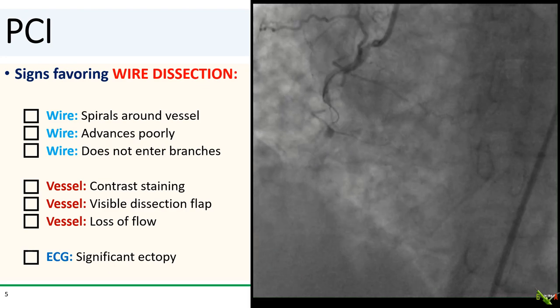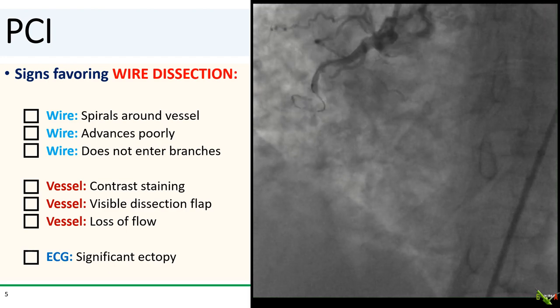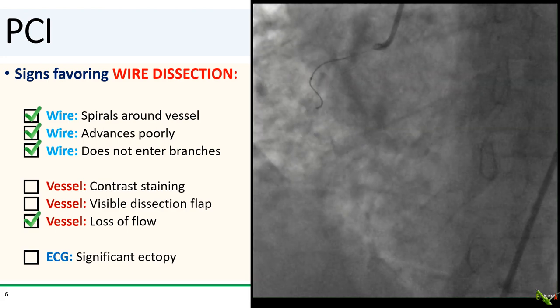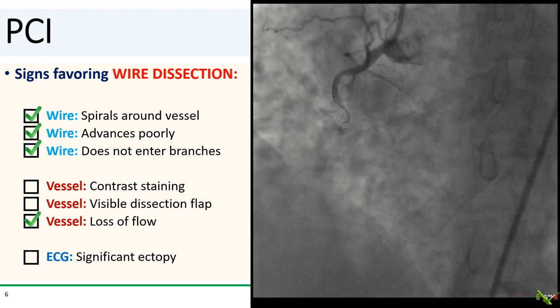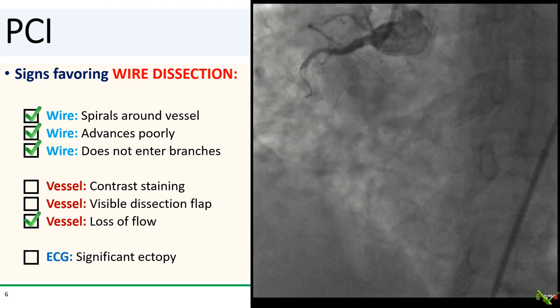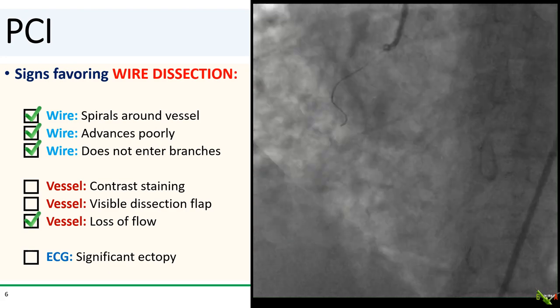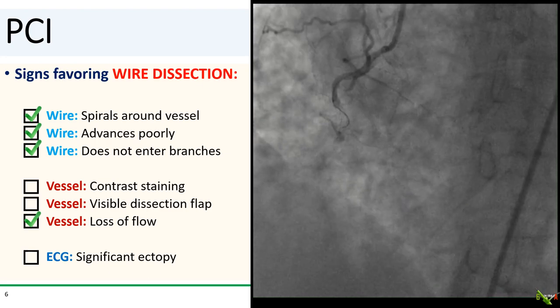If you have a lot of ectopy, your wire might have actually exited the vessel architecture — pull it back. For us, our wire is spiraling around the vessel, difficult to advance, and is not taking any side branches. There's no clear contrast staining or dissection flap, but we do have loss of flow. The patient's ST segments are also now starting to go up, and she is complaining of chest pain. I think we have a wire dissection, and the RCA is going down.